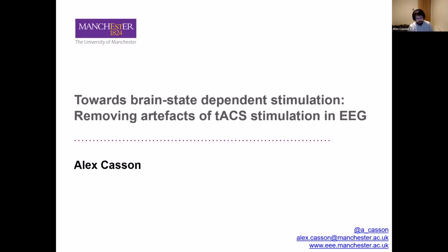What I'd hope to convince you in this presentation is that at a gross level, dealing with that artifact is pretty easy. We can apply several different signal processing techniques and get some neural data as a result. And actually, the challenge is less the hardcore signal processing, which there's lots of different things you can do. It's more about the validation and verification, and how do you convince people that you've actually done this. And then, of course, that's at the gross level. When you get to the residual artifact level and some of the second order effects, the physiological artifact, the nonlinear effects, actually it is really tough. And indeed, I think the next speaker is going to be speaking specifically about residual artifacts.